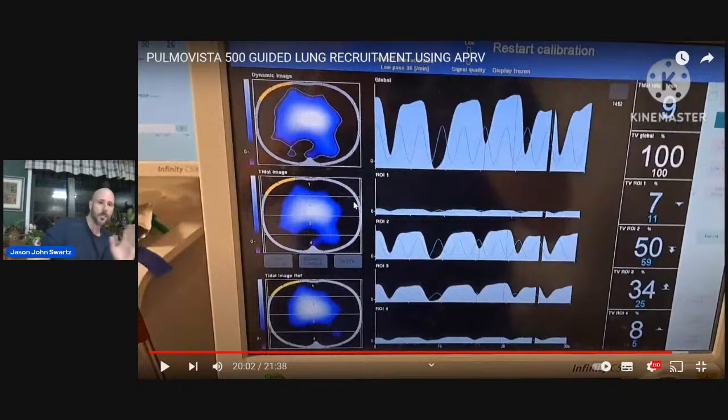It'd be a perfect blue marble. But everything's normal now. 7, 8 to 15 is the norm. And look, this is a lot lower because now these numbers are bigger. It's exactly what we wanted. He was at 25, now there's 34 distributed. There's only 5, now we're between 8 and 15. We've normalized it.